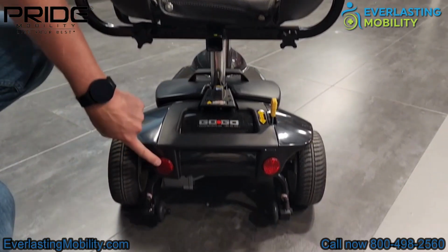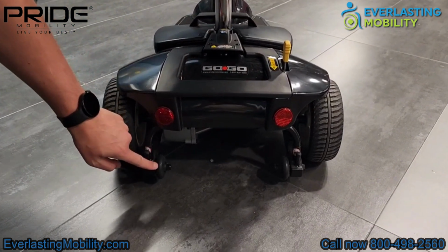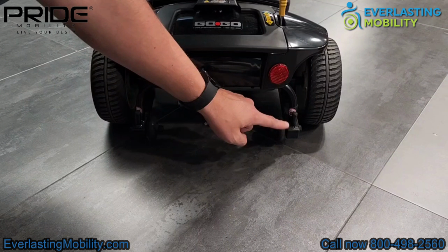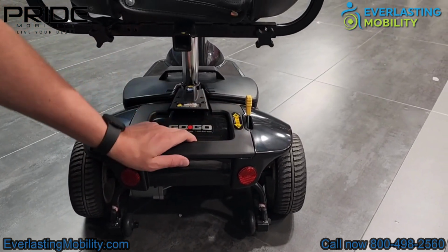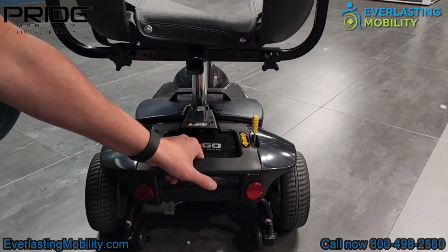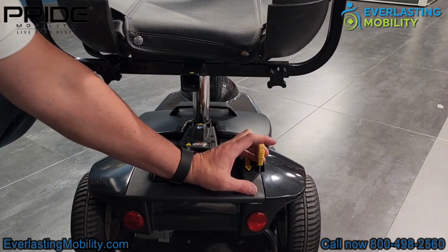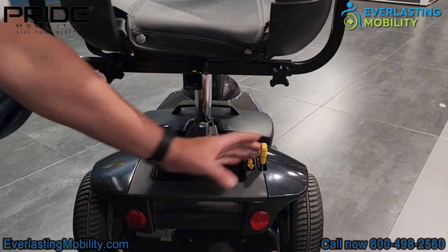At the bottom of the scooter, there are 2 rear reflectors, and there's 2 anti-tip wheels for added safety. So in case you're going up an incline, you have a safety feature of the anti-tip wheel so you don't tip backwards. This yellow lever is the freewheel lever. So if you press it forward, it'll put it into neutral, and you can push the scooter if you were to run out of battery. However, you can't operate it when it's in the neutral position. You have to push the lever back down so it's engaged, and that way when you operate the scooter, the electromagnetic brakes will work as they should.